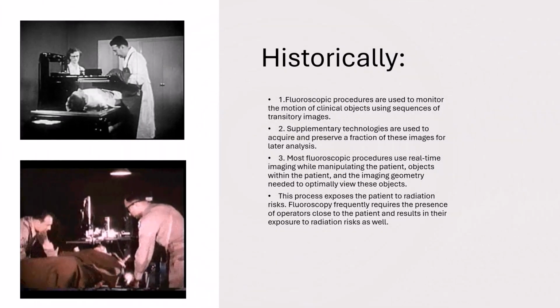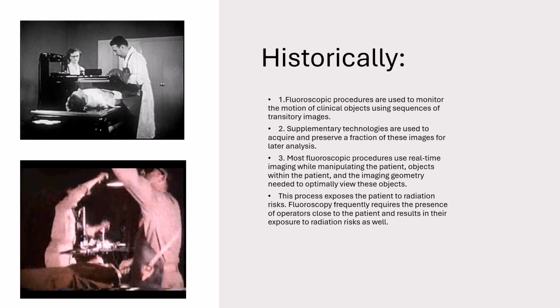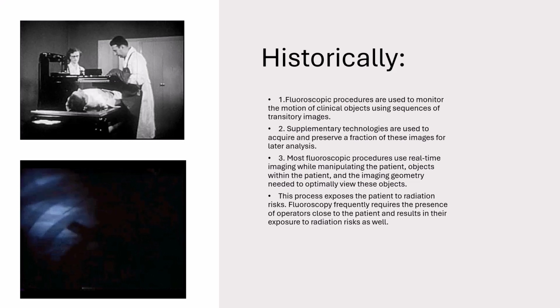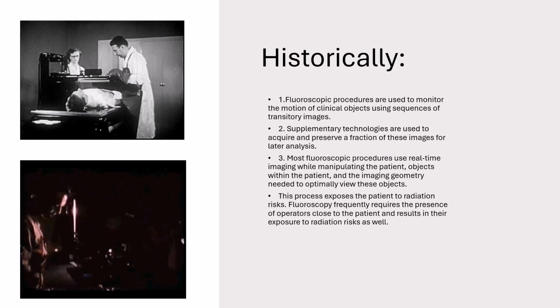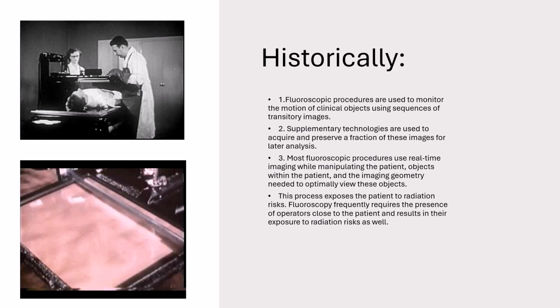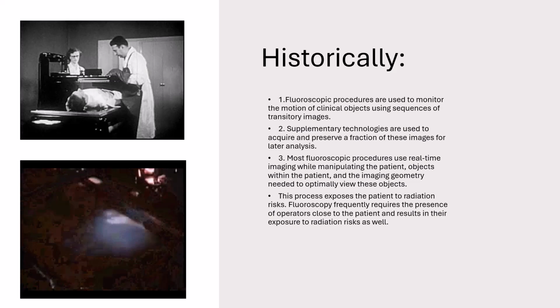Fluoroscopic procedures are used to monitor the motion of clinical objects using sequences of moving images. Supplementary technologies are used to acquire and preserve a fraction of these images for analysis later. Most fluoroscopic procedures use real-time imaging while manipulating the patient, objects within the patient, and the imaging geometry needed to optimally view those objects. This process exposes the patient to radiation risks.